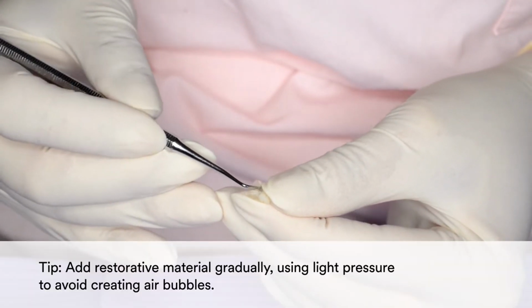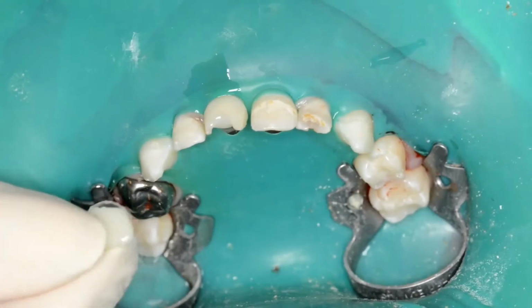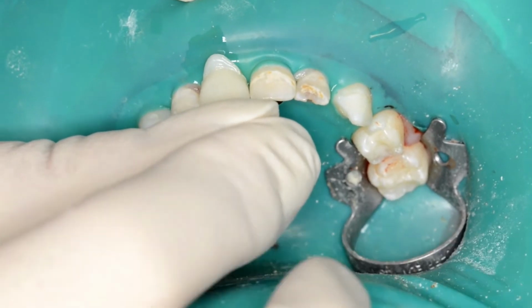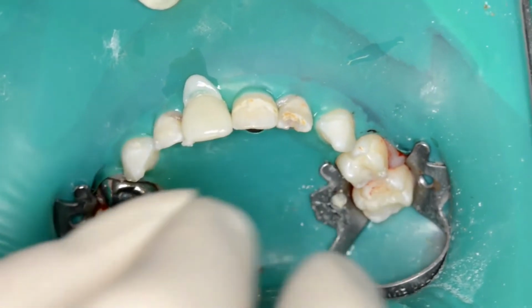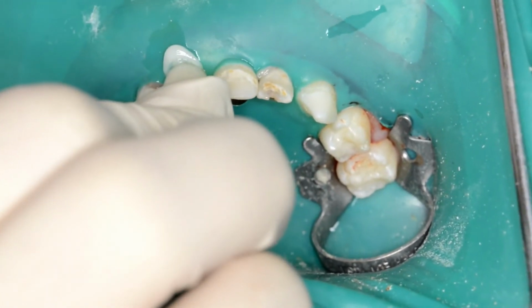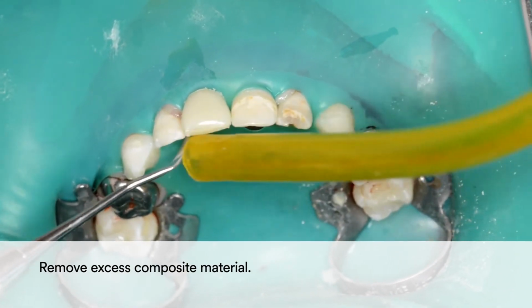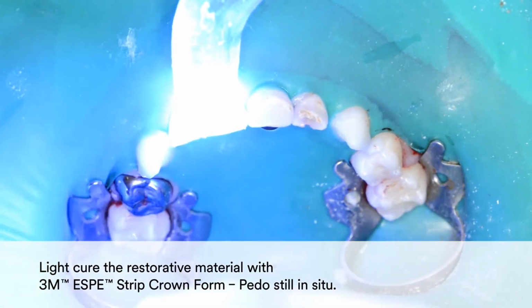In order to avoid creating air bubbles, add the restorative material gradually using light pressure. Gently press the 3M strip crown form onto the tooth abutment. Remove excess composite material. Light cure the restorative material with the 3M strip crown form in place.